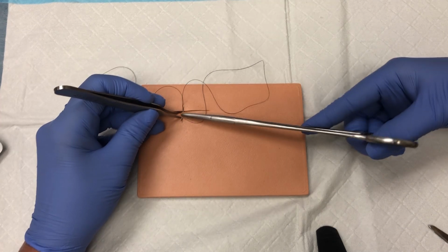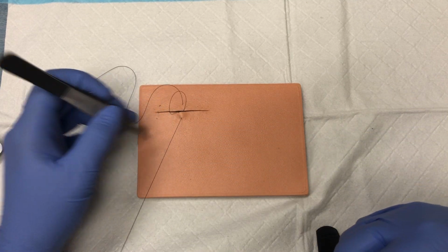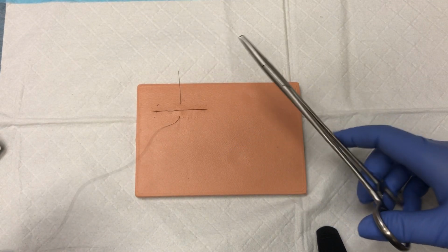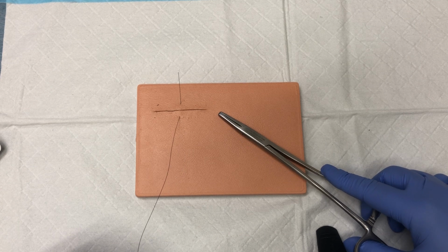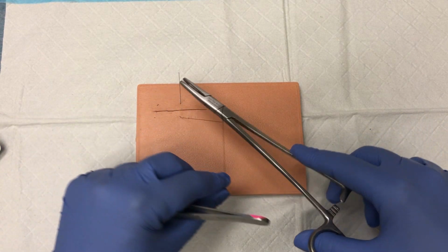This ensures that the tissue will actually be well approximated, that you won't have one side being more superficial than the other, or more proud, I should say, than the other. Lots of different ways to actually tie this. You can do an instrument tie, realizing that nylon has a lot of memory.